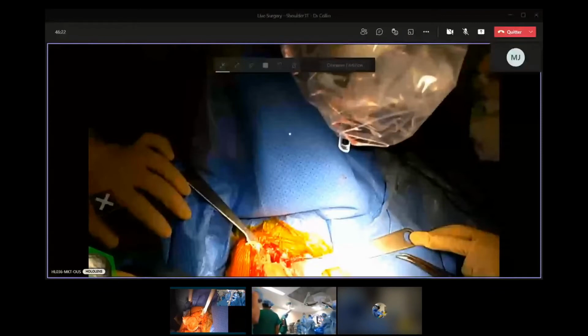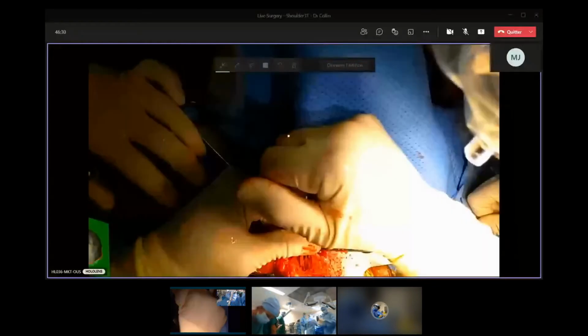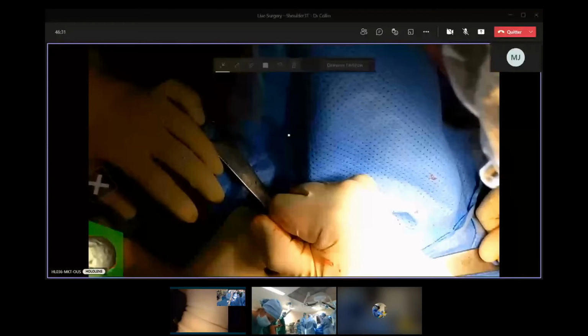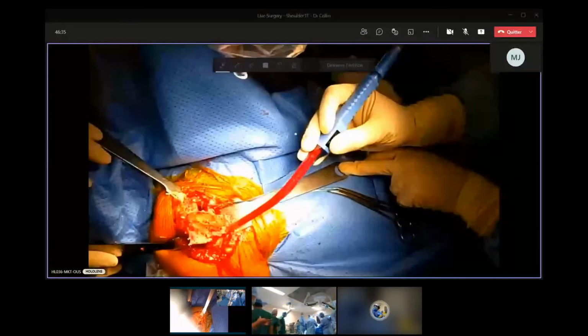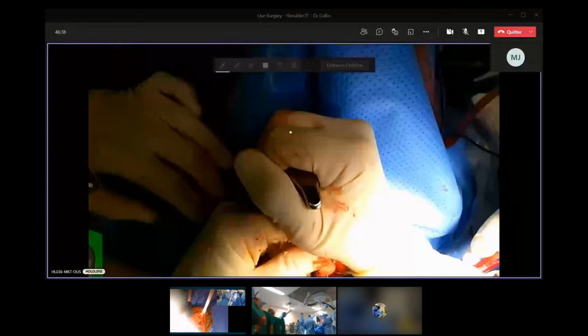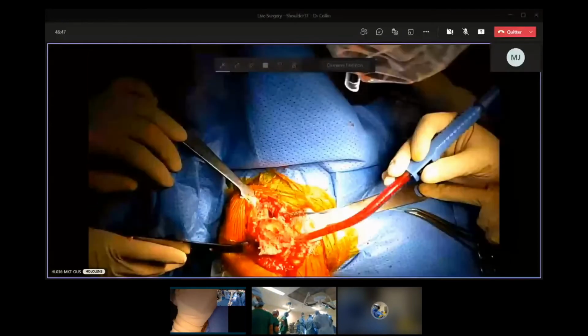So now we're going to calibrate the diaphysis like this. We're going to be very soft, very gentle, because it's an old lady. Okay. Ouais, non, c'est bon. C'est bon. On commence en 1.